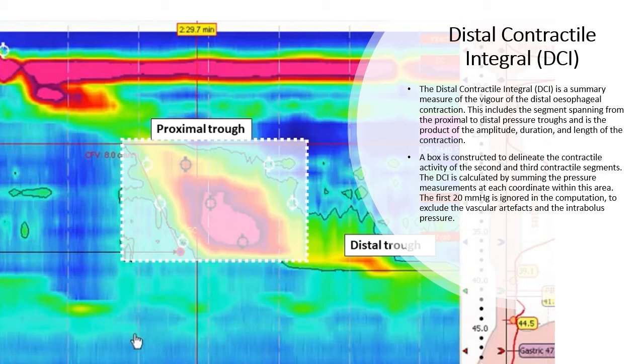A box is constructed to delineate the contractile activity of the second and third contractile segments. The DCI is calculated by summing the pressure measurements at each coordinate within this area. The first 20 mmHg is ignored in the computation to exclude the vascular artifacts and intrabolus pressure.